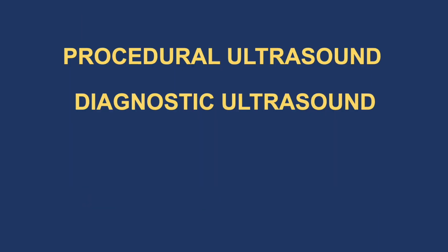There are 2 types of POCUS. First, there is procedural ultrasound. Using ultrasound guidance when doing procedures, such as putting in central lines, paracentesis, thoracentesis, or pain procedures, has been shown to be more comfortable for the patient since the proceduralist is able to be more accurate and does not require as many attempts. Ultrasound guidance for procedures is now the standard of care for most procedures because of better accuracy and less complications.